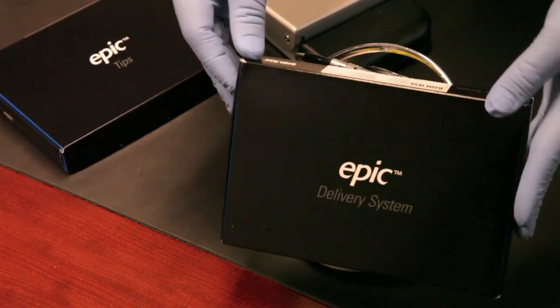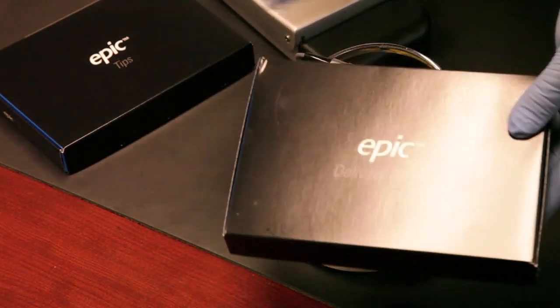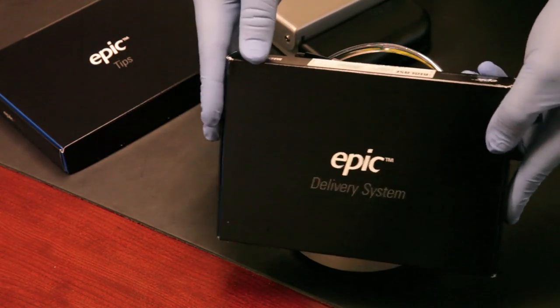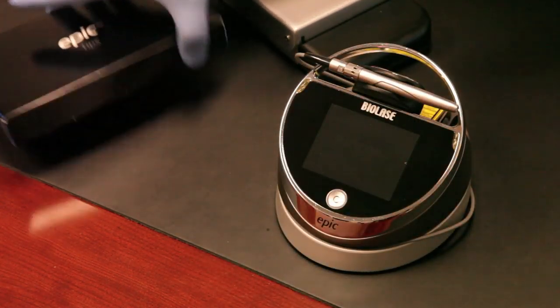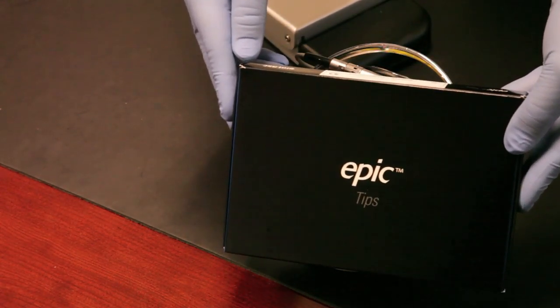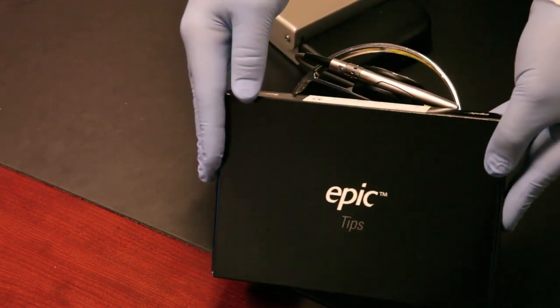The delivery system also comes in a package inside the EPIC box, and you'll install the delivery system at the time you get the laser in your office. It's very easy to do — there are good step-by-step instructions. The system also ships with a box of 30 disposable single-use tips that you apply to the surgical handpiece.